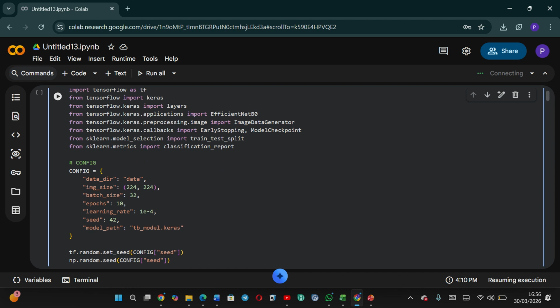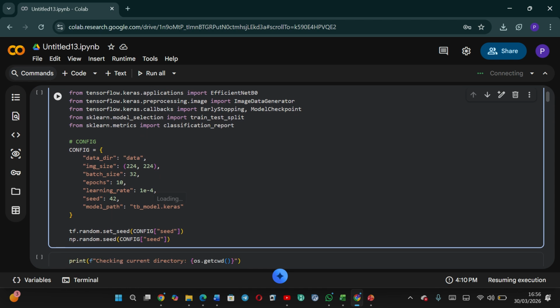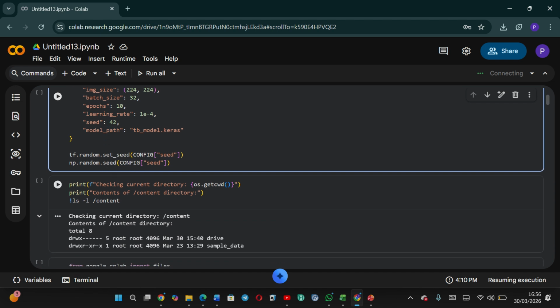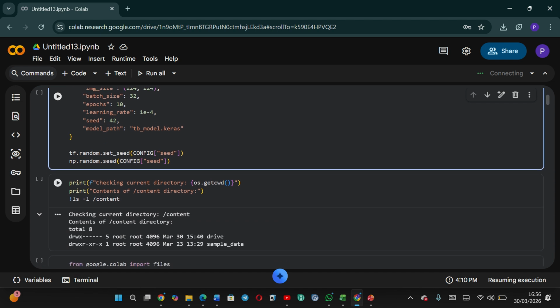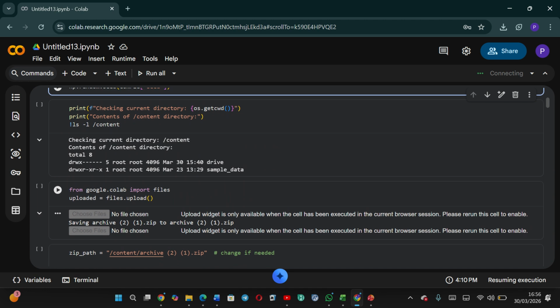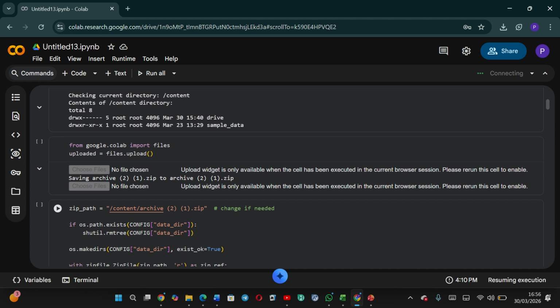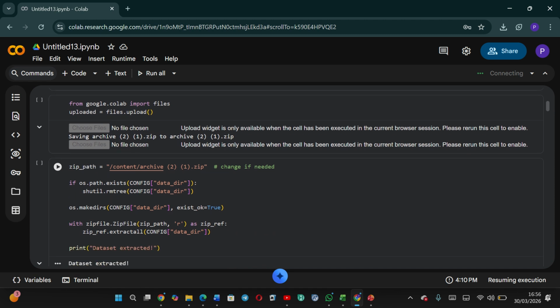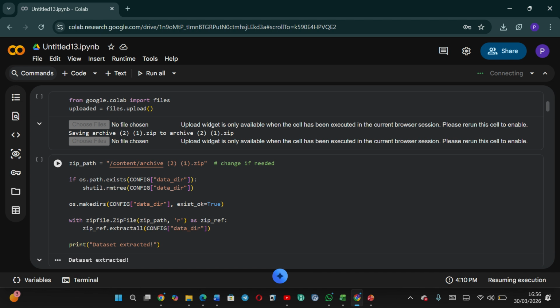Then we also defined a configuration dictionary called config, which stores important parameters like the image size, batch size, learning rate, model path, and the seed. The next code checks the working directory and displays its content. Since it runs in Colab, we upload the datasets manually using files.upload. This allows us to bring in the TB X-ray datasets as a zip file.